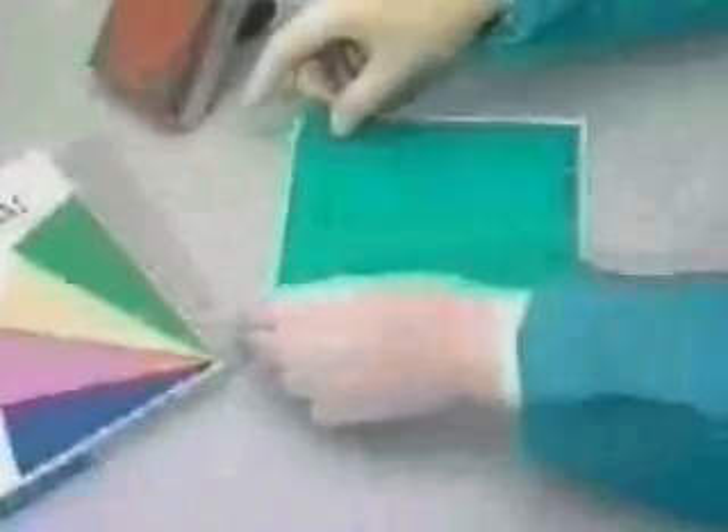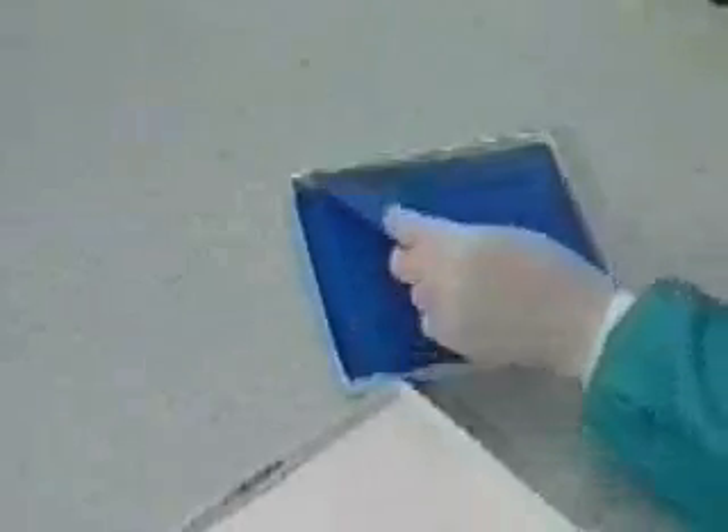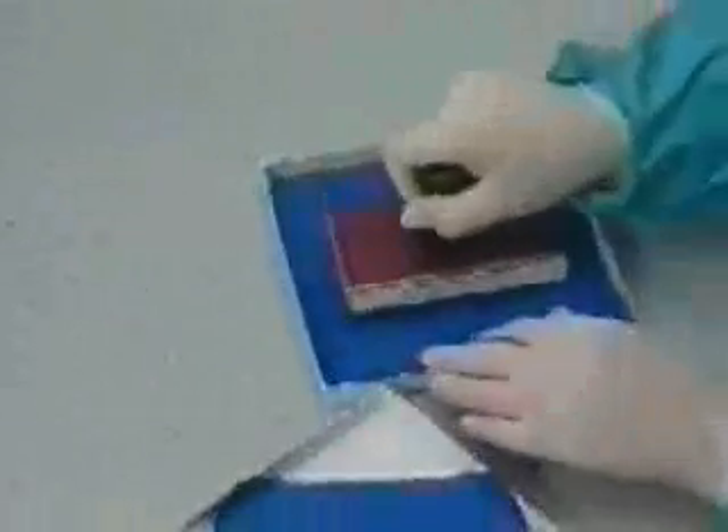Now let's review a general scenario for preparation and placement of the rubber dam. First, you must mark the holes to be punched in the dam. This can be done with a pen and template manually, or with a pattern stamp as shown. Marking holes ensures that the proper number of holes are punched in the dam and makes it easier to keep proper arch form.